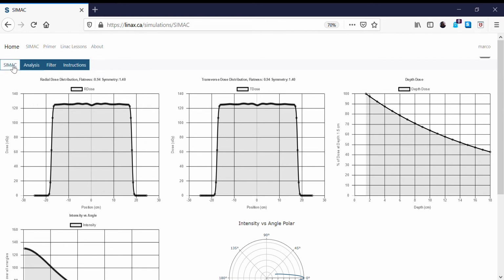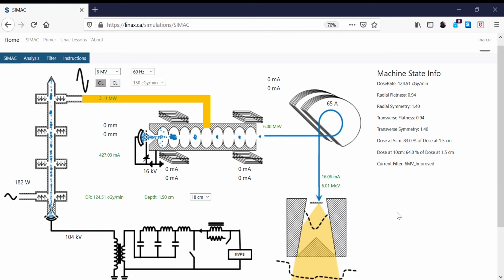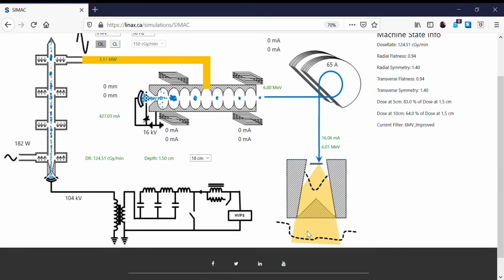SIMAC has a feature by which we can explore the effect of beam symmetry when we have an imperfect beam. Over here we have steering coils, but we also have gun errors: a radial gun error and a transverse gun error. What can happen to a clinical beam is that if the electron beam from the gun is not centered perfectly, the electron can end up on the target in the wrong position, and it'll end up producing a beam which is not flat. We show this schematically here on the main SIMAC screen.